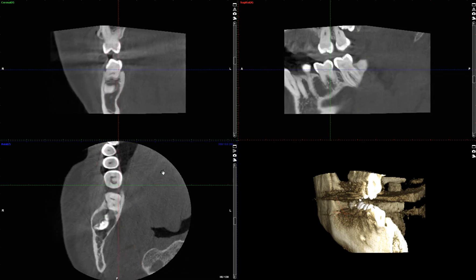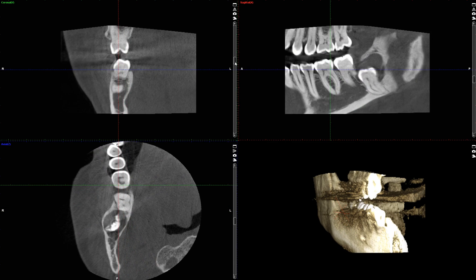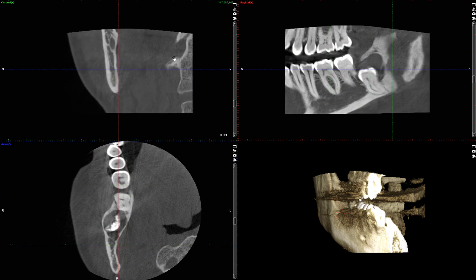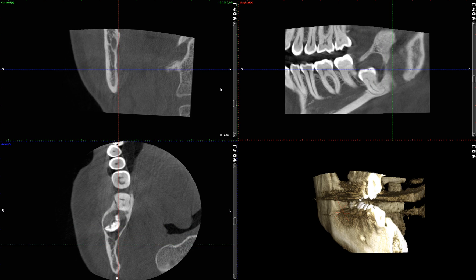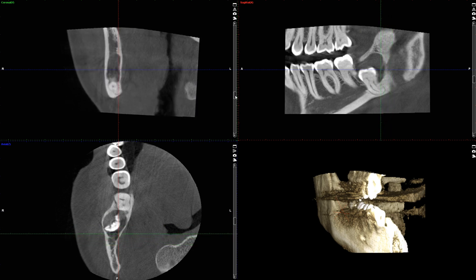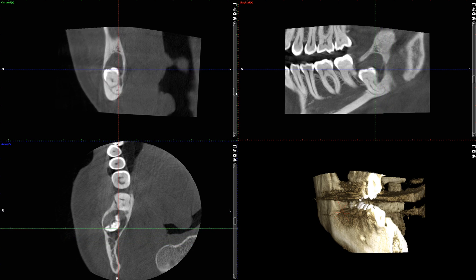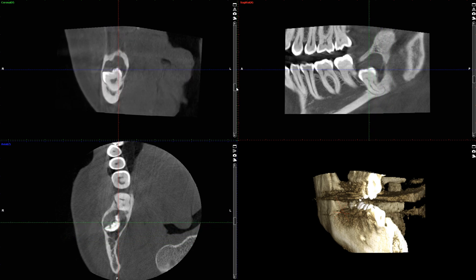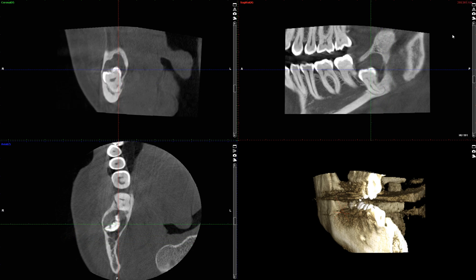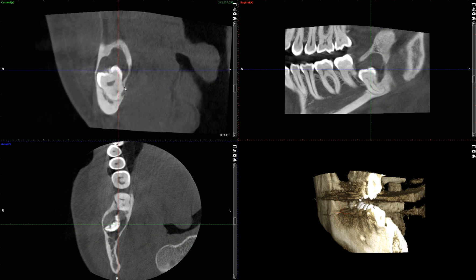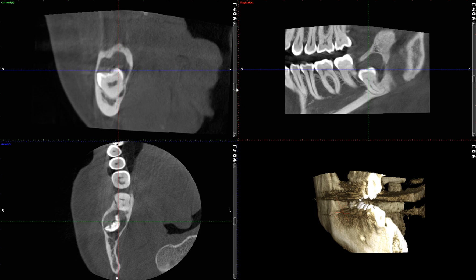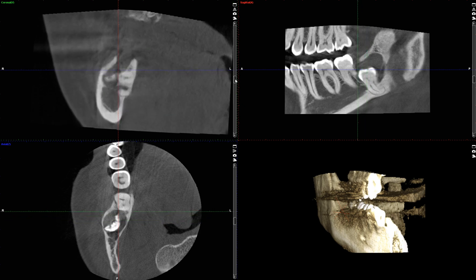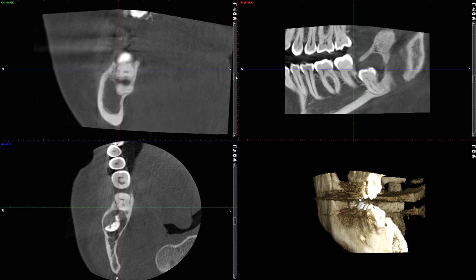Let's look at that one more time, this time without the highlighted mandibular canal. As I'm coursing anteriorly, you can see it coming down, coursing medial and lingual to both the lesion and the impacted third molar. Can you see how small, thin, and constricted the canal is? This is a good clinical indication that when you extract this third molar, you run a high risk of injuring the nerve.